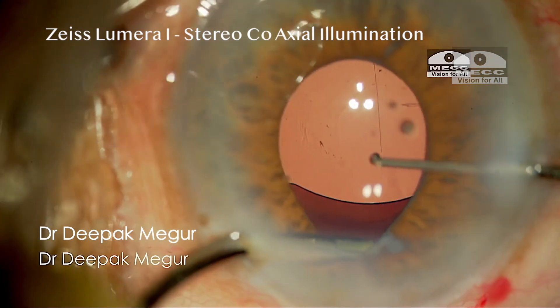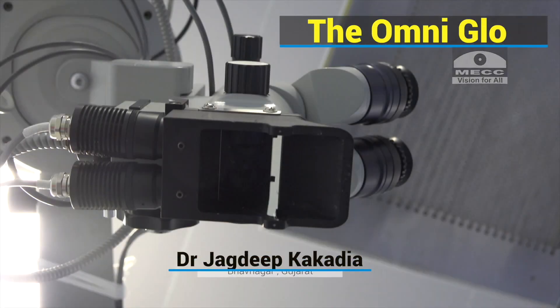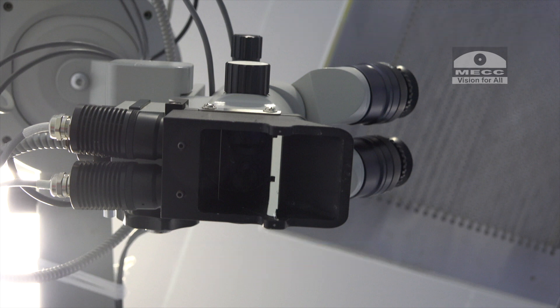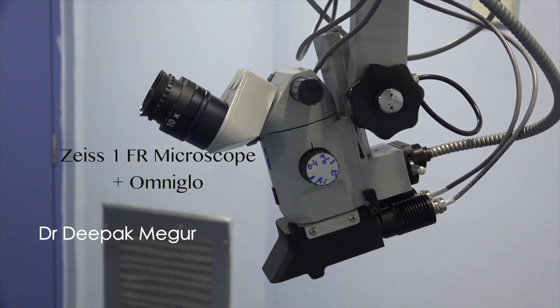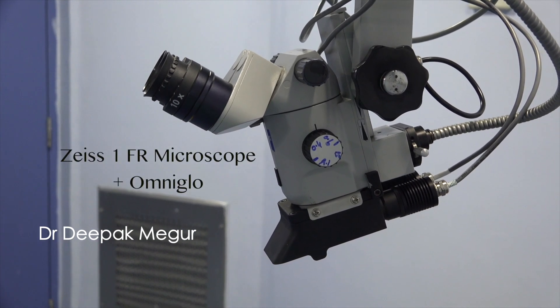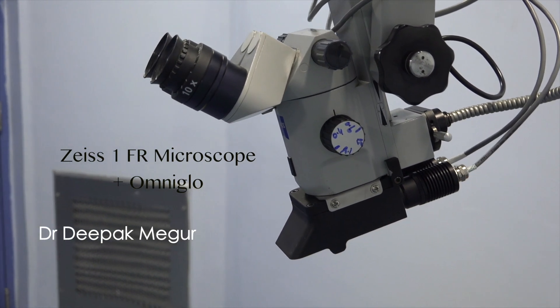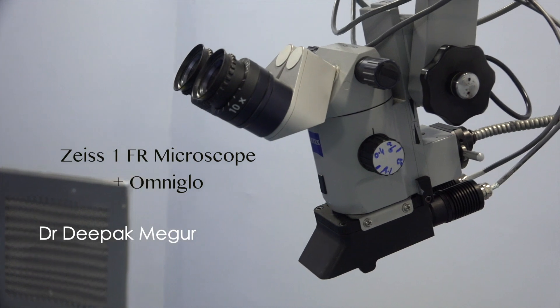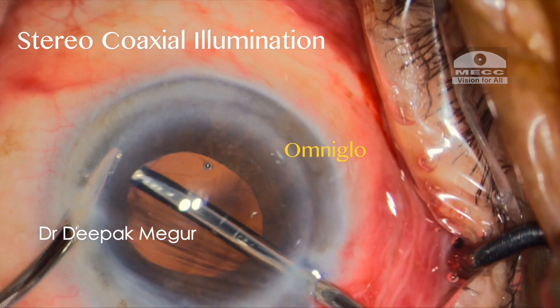I had heard of a device called the Omniglo a couple of years back, created by an ophthalmologist Dr. Jagdeep Kakadiyev from Bhavnagar, Gujarat. I couldn't get my hands on it for a couple of years, but a few months back I managed to buy one — for my old Zeiss 1FR microscope, which is our standby microscope. This device was supposed to provide stereo coaxial illumination similar to that of the Lumera.